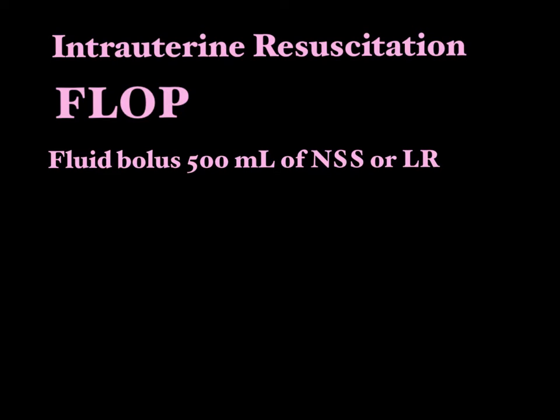One of the reasons we like this on a pump, I know some places still do it by gravity, is that it's pretty easy to tell which one is your LR, and you can open that wide. If you're hanging that and Pitocin, you certainly don't want to open your Pitocin by accident, and that has happened in the past. So make sure your bags are well labeled and make sure you're paying attention when you do this. So that's F for fluid bolus.